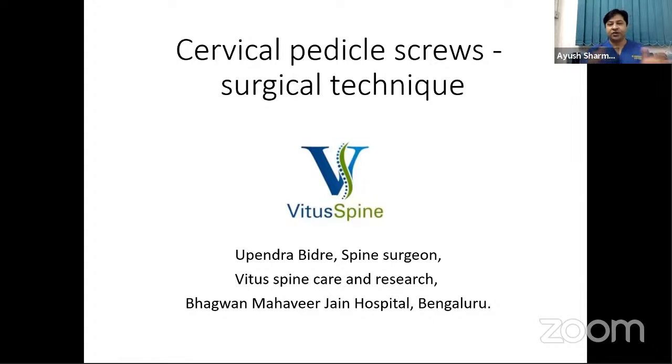The reason being, your dura is closed. As I showed you, I can let the burr rest on the lamina of the level below. So that gives me a very stable angle. And I can angle as much as I want when I'm doing the lateral mass. The only problem when you're doing your lateral mass screw first is sometimes the laminectomy might be difficult if you have not started at a correct lateral margin. So you have to make sure you're starting lateral to the lamina. That is the only problem. But in most of my cases, I prefer doing a lateral mass fixation first.